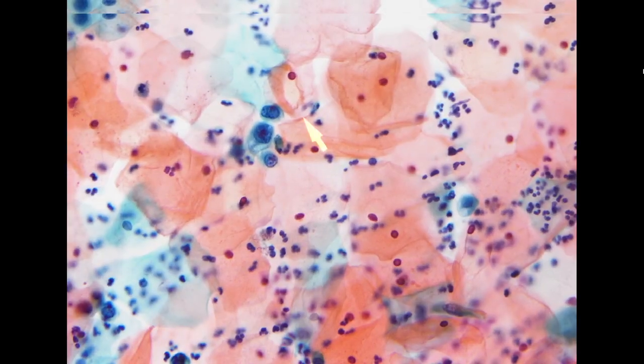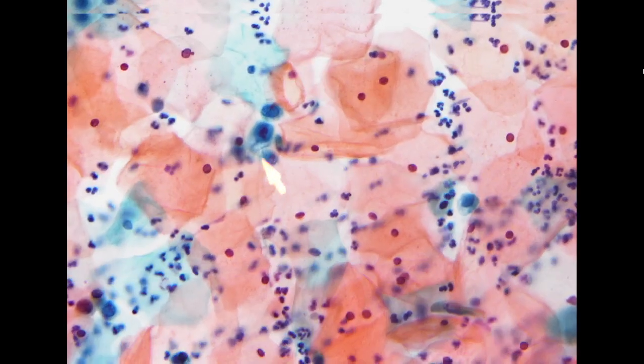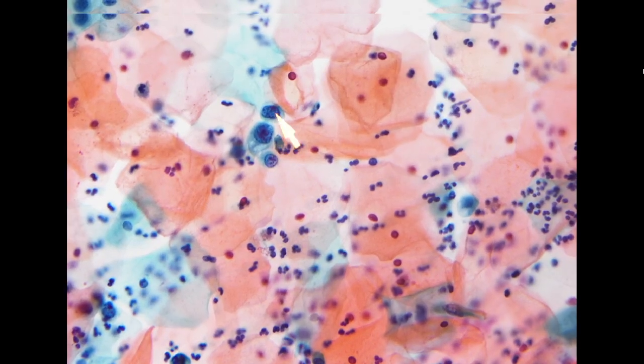This is relatively difficult to screen, so our screener is doing a good job identifying these darker cells with higher NC ratio hiding in the sea of superficial cells. So we all start to find similar cells.